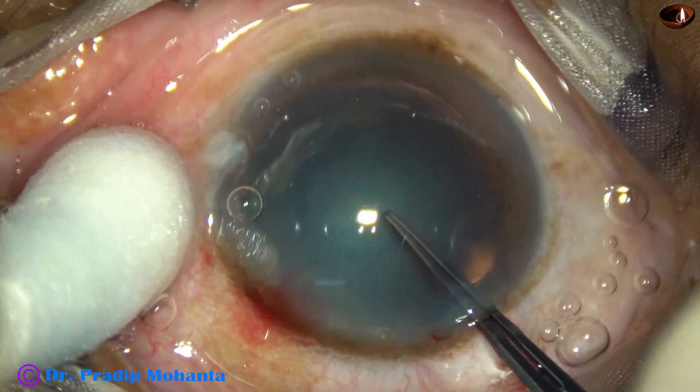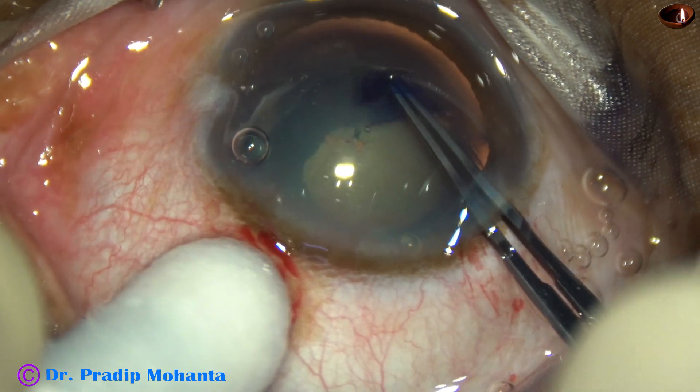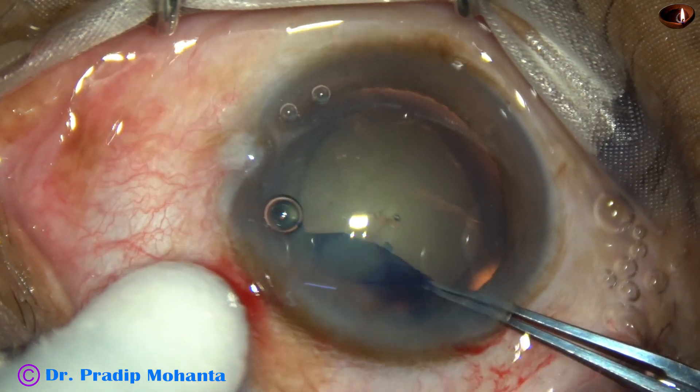The anterior capsule is torn at the center, a capsular tag is raised. This capsular tag is guided all around and in this case, an oval capsulorhexis was done.